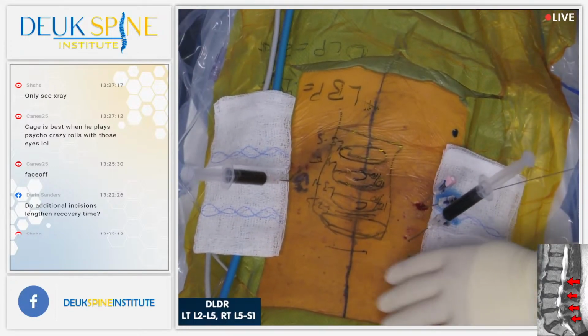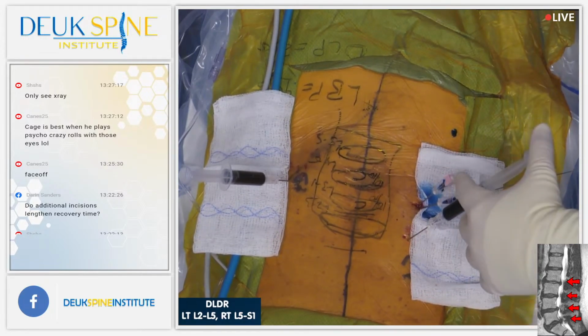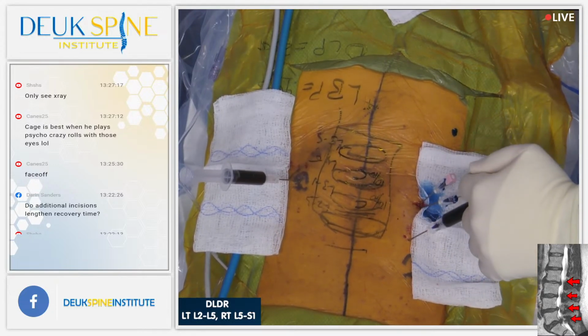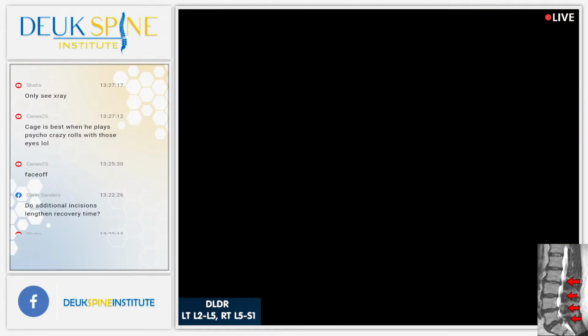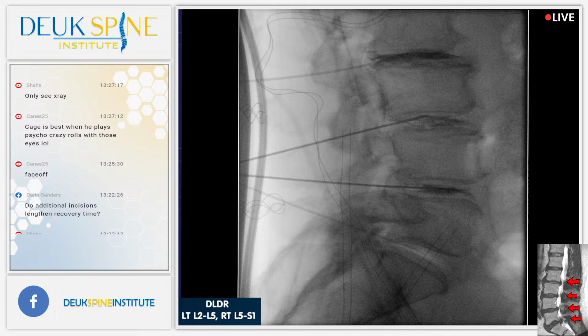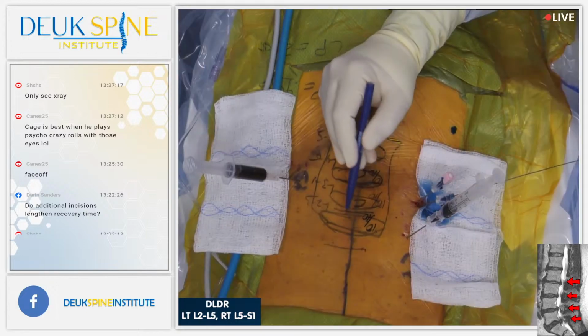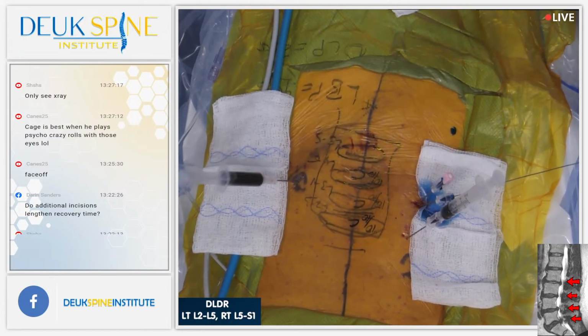Is it better? Any pain? All right, he's better. Shot? Having trouble there. We go. How bad is that on a scale of 1 to 10? What number? 10. Is that where you get back pain every day? Is that where you get your back pain? Yes or no? Yes.